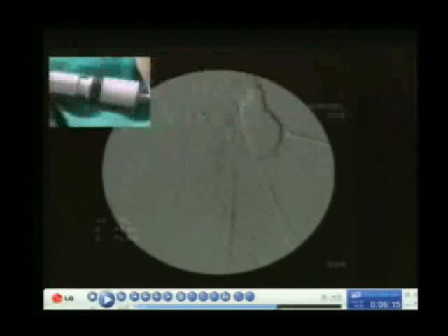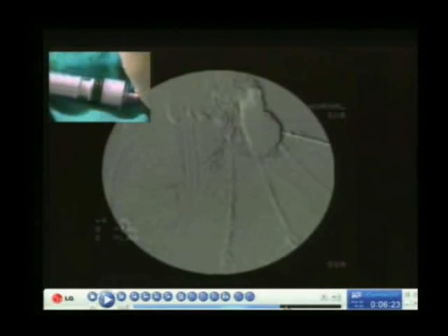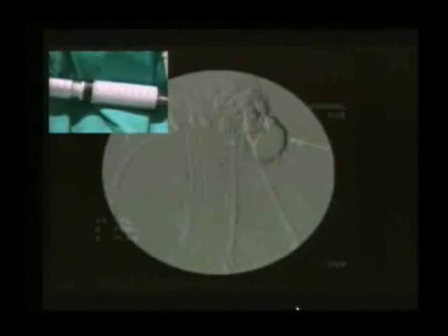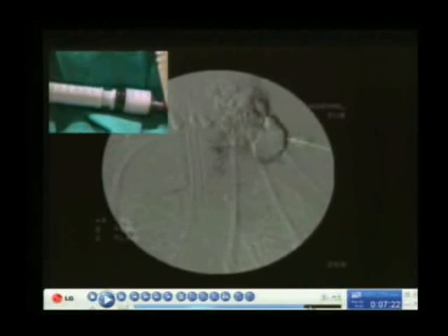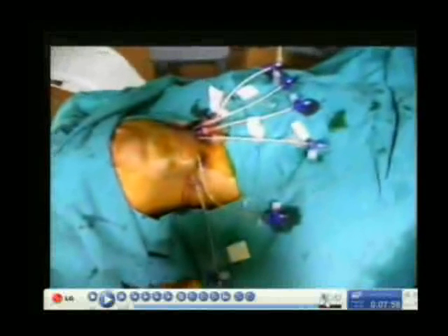The superficial effect, seeing the foam going in. Can you see venous filling, but injection continues because the leading edge is contrast. Now the advantage of having all the needles in place is you simultaneously sclerose the whole volume together at once. You have no dilution with any blood coming in. So technically you expect the results to be better. And you can see the whole area getting more and more tense and bigger.